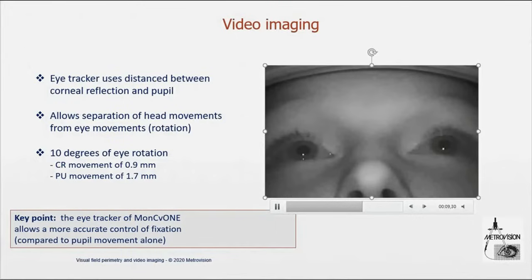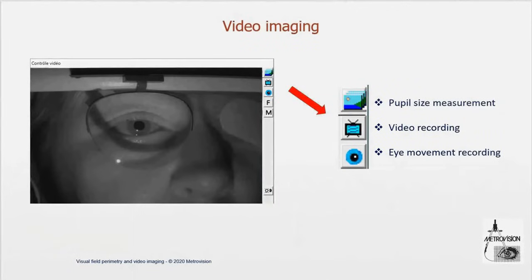On the video interface, you have three different functions. The first button on the top allows you to measure the pupil size. The second button allows you to start video recording. And the third button allows you to start eye movement analysis in real time.